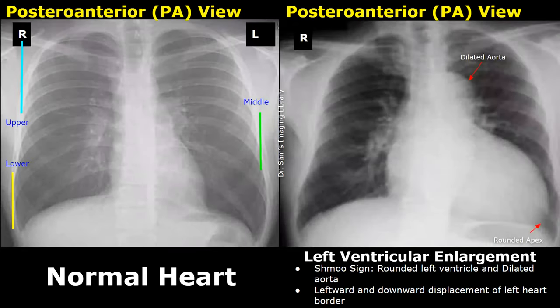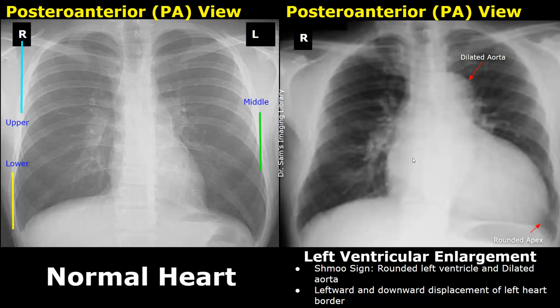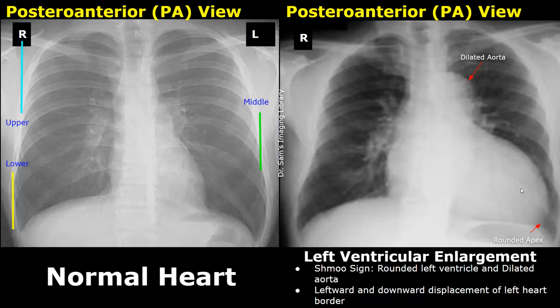Now we move on to left ventricular enlargement. Its features include the Schmoo sign, which refers to a rounded left ventricle and dilated aorta — the word 'Schmoo' is a comic book character which has a similar shape as seen on this X-ray. There is rounding of the apex, dilation of the aorta, and leftward and downward displacement of the left heart border.